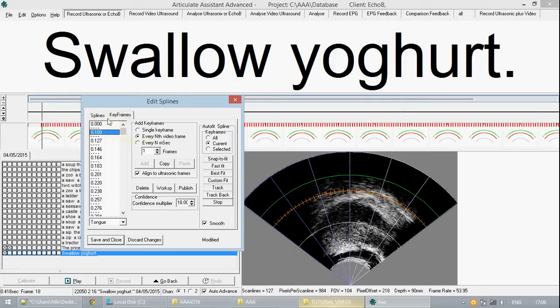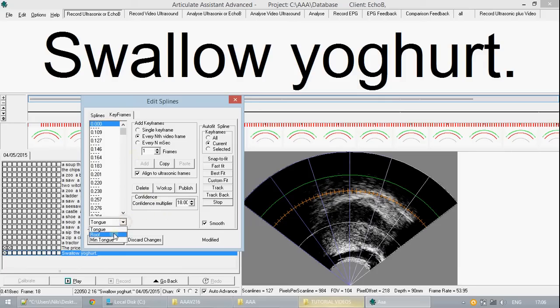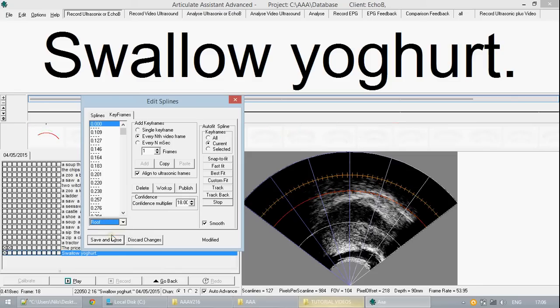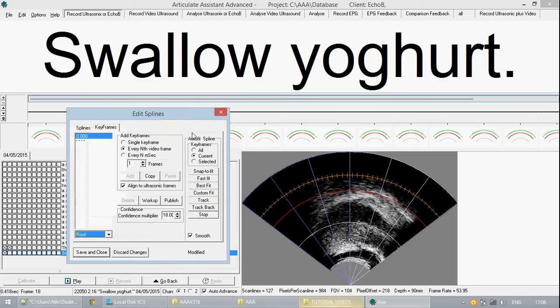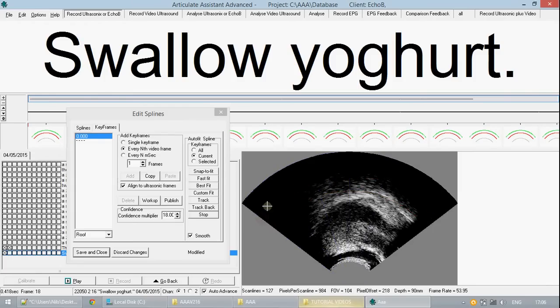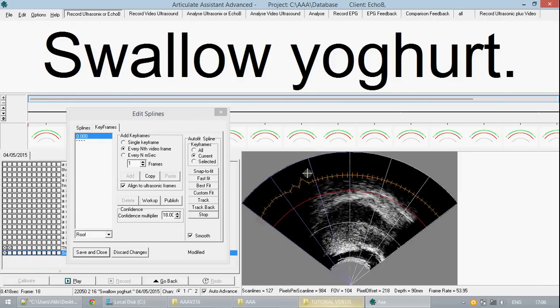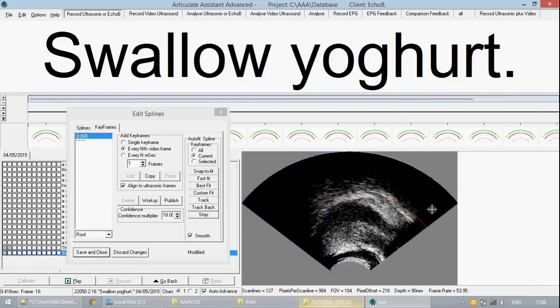Now if we return to the very first one we can edit the properties of the contour. We will start with the roof. While this dialog is open you can freely draw on the ultrasonic image with the mouse and in doing so change the contour of the selected spline.